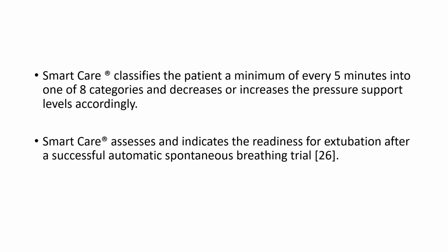SmartCare classifies the patient a minimum of every 5 minutes into one of 8 categories, and decreases or increases the pressure support level accordingly. So, SmartCare assesses and indicates the readiness for extubation after a successful automatic spontaneous breathing trial.